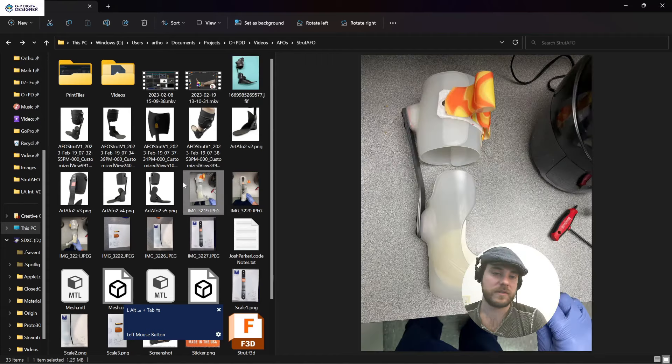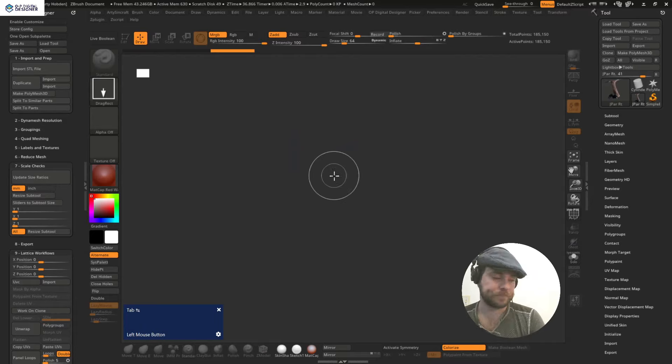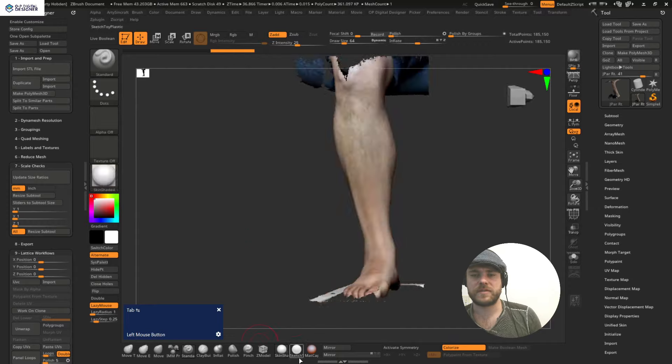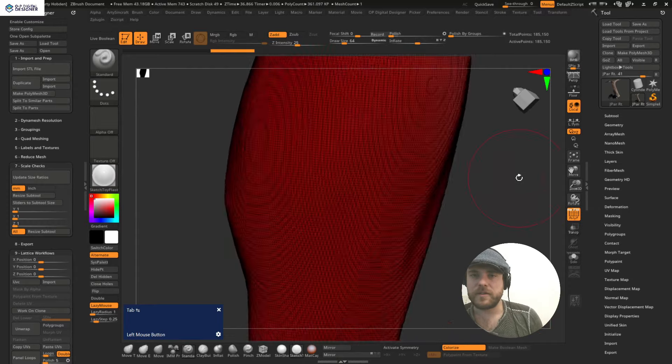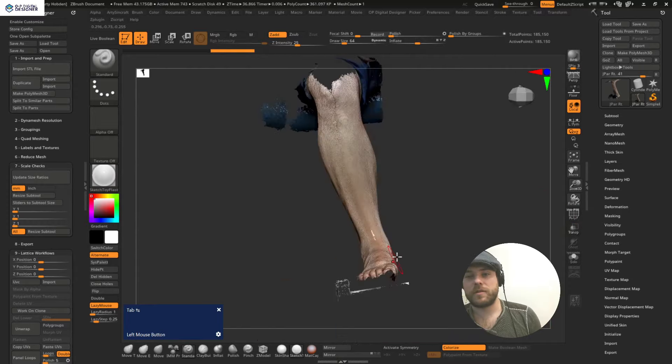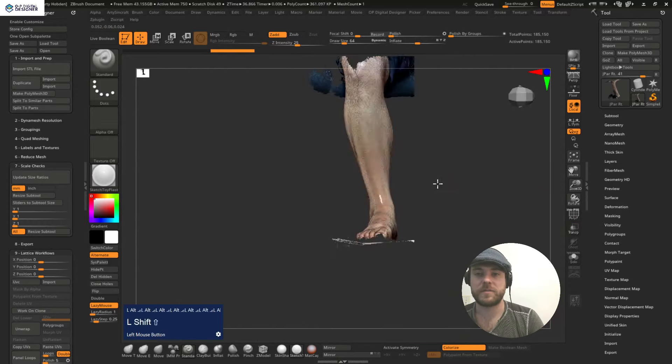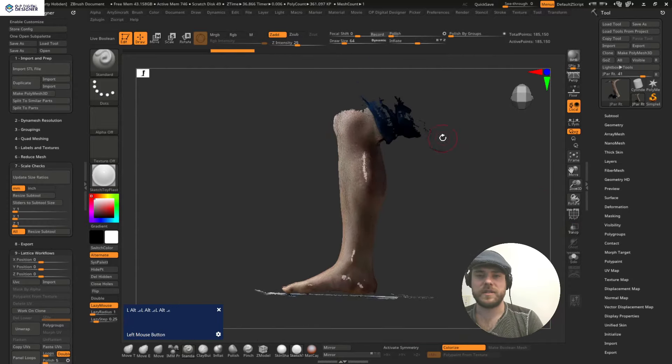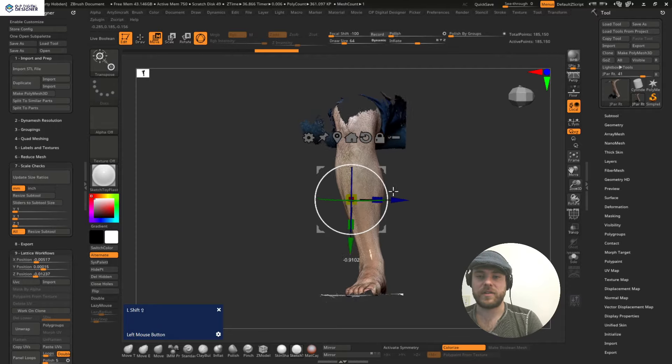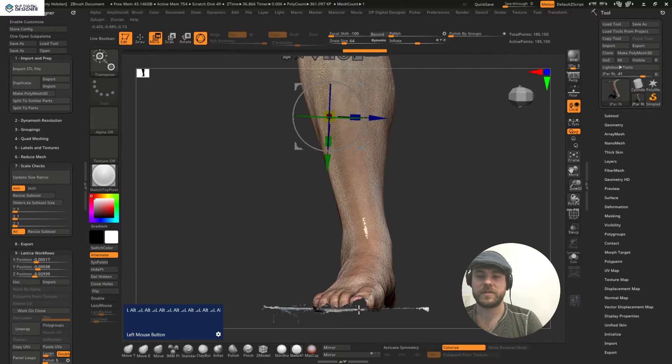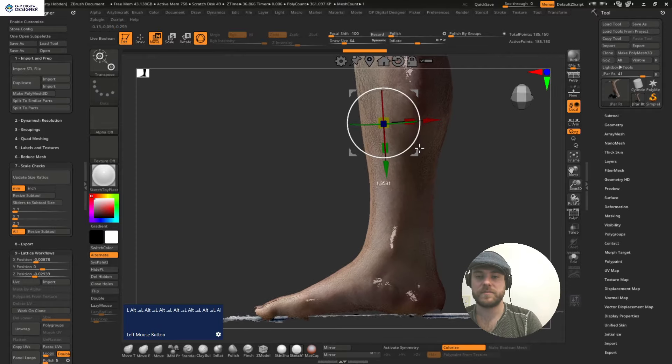This course will dive right in and start off with a scan straight from an iPhone where we edit, align, clinically modify and create trim lines from the scan in ZBrush for our device.